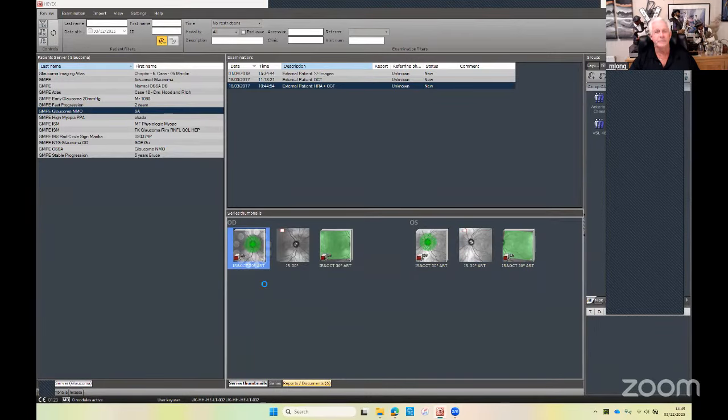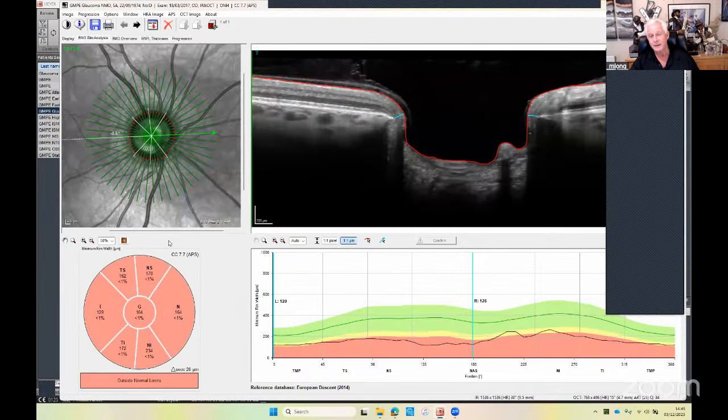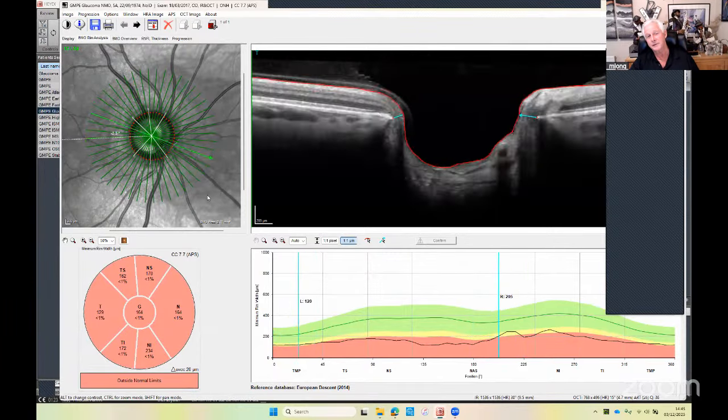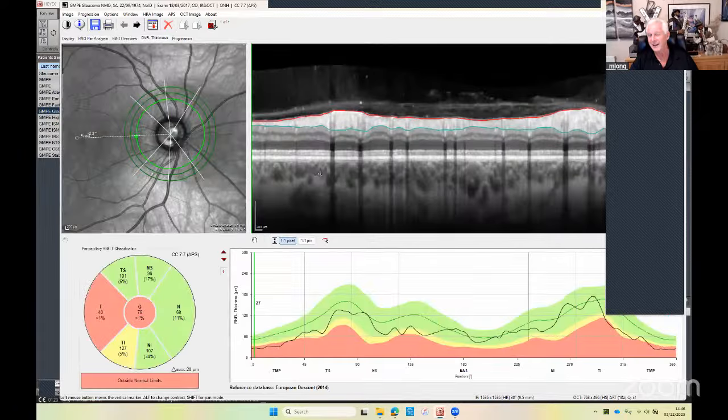So again, a three-step process, from the rim. And you can look on the rim here, we can see all of the locations of Bruch's membrane opening. Makes sense, they're nicely followed around. It's quite cupped out, thin rims, a completely diffuse neuroretinal rim, and he's 42 years old. So something's happened, and I would have expected to see an extremely thin nerve fiber as a result of that, looking at the neuroretinal rim. But if you look at the nerve fiber, it actually is not too bad.